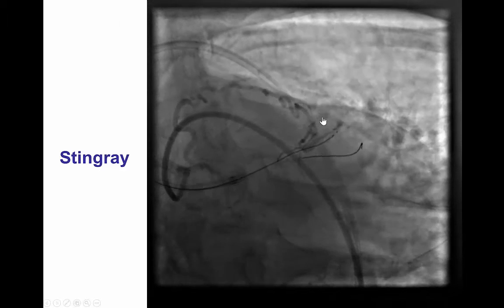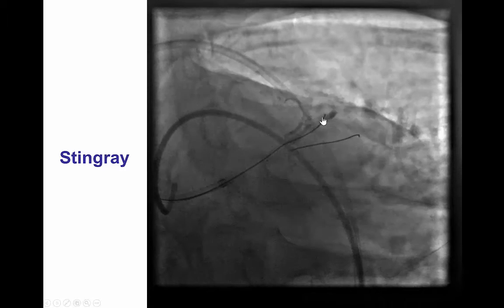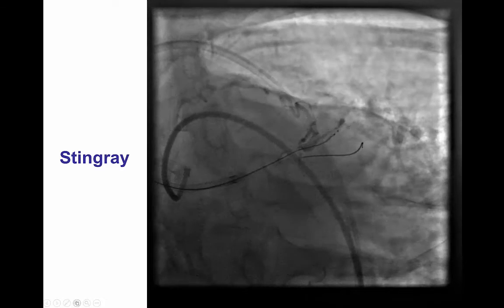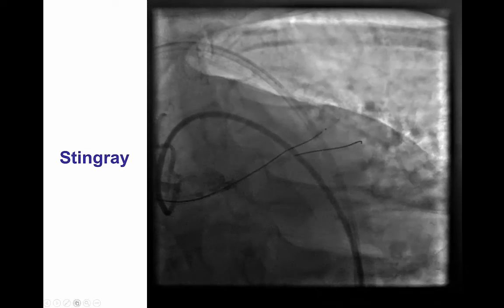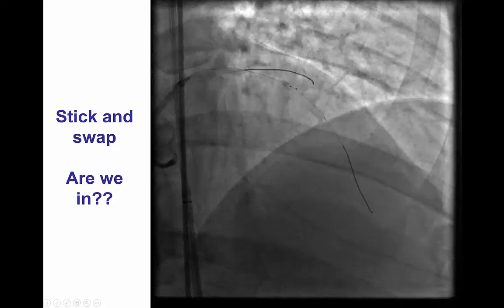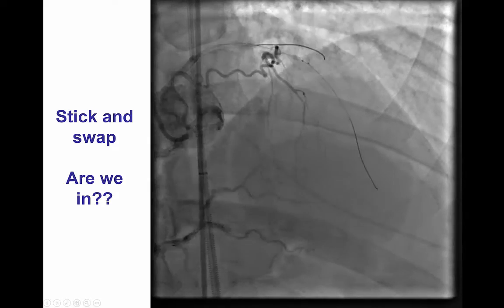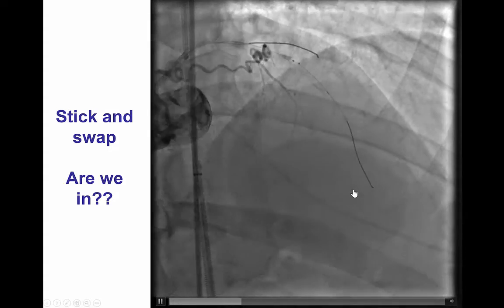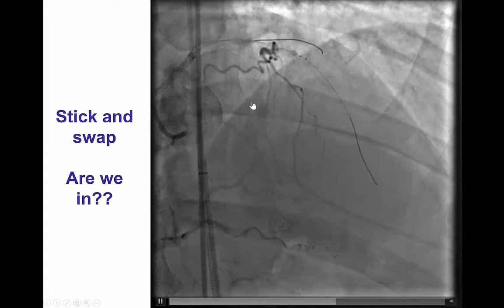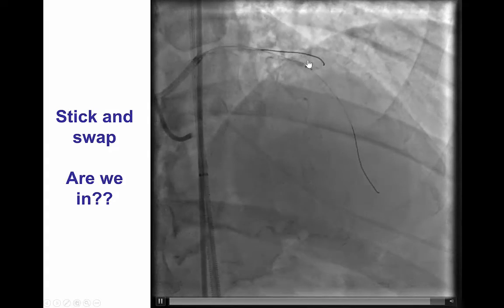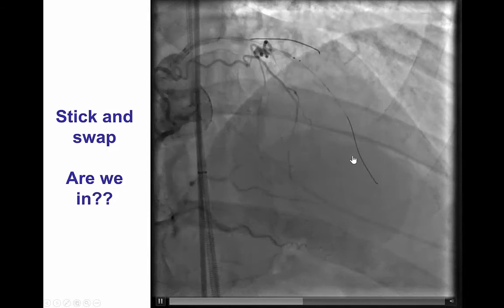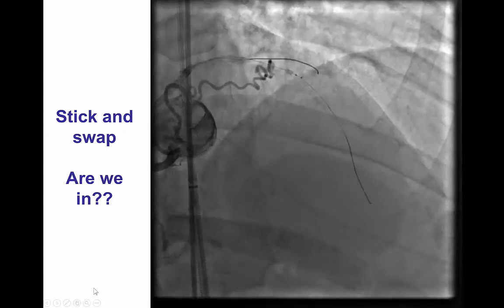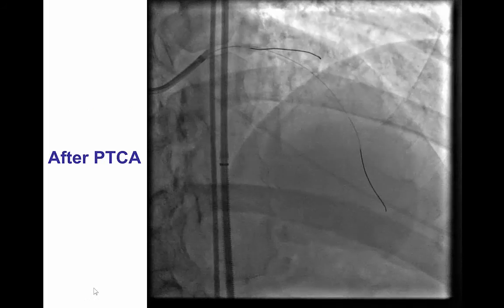After doing that, we tried to re-enter using a Stingray system. You can see the Stingray wire exiting from the side ports of the Stingray in between the two markers. Then, by using the stick and swap technique with the Stingray wire followed by a Pilot 200, we were able to advance the guide wire into the anticipated course of the LAD. However, the problem here is that in the dissection, the antegrade flow had now ceased. We were able to advance the wire into various branches and were fairly confident that the wire was in the vessel.